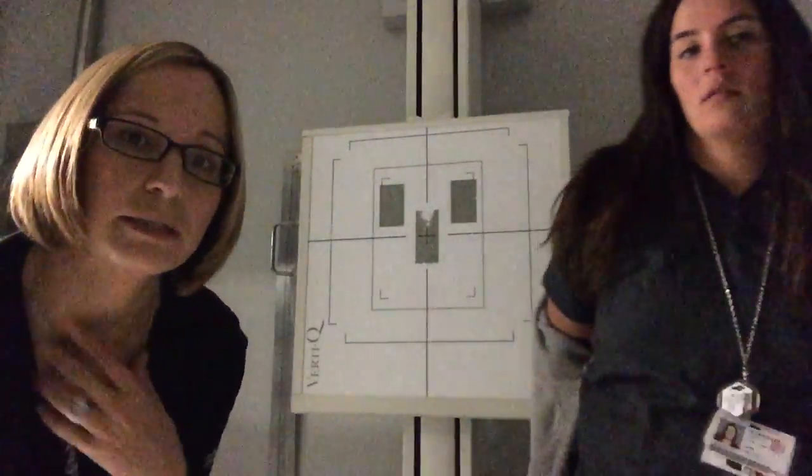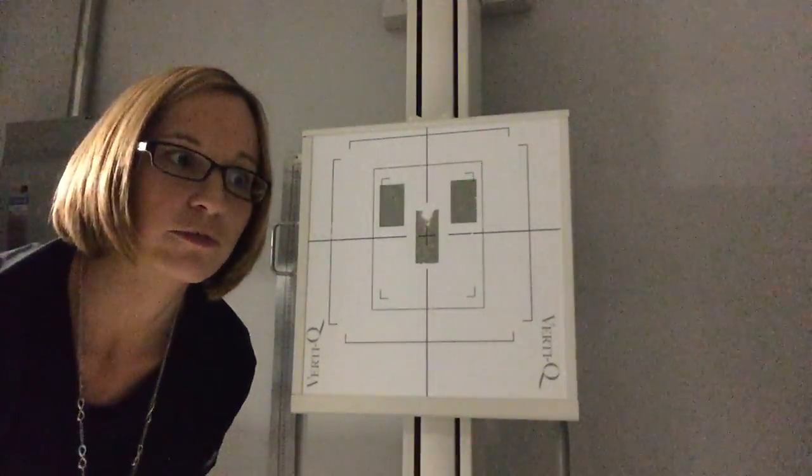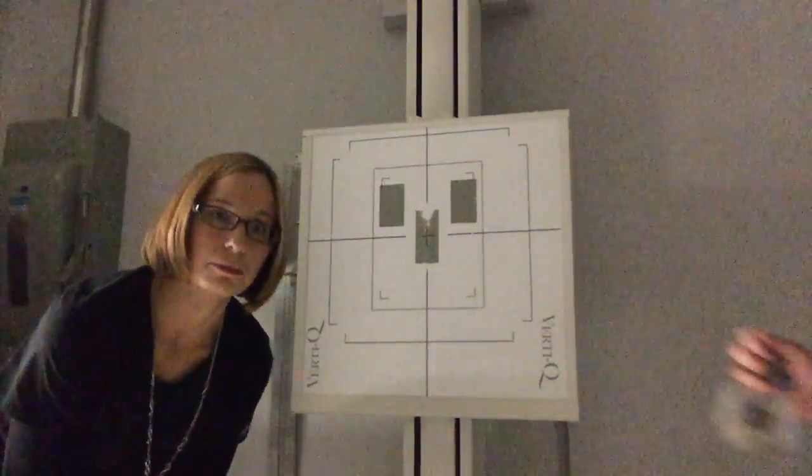I'm going to have my patient, Mrs. Marshall, stand with her back up against there. It's going to be important when you're doing any projections for the C-spine that they remove jackets, zippers, badges, earrings, necklaces, collars, and buttons — anything that's going to show up in the C-spine either front or back is going to need to be removed.